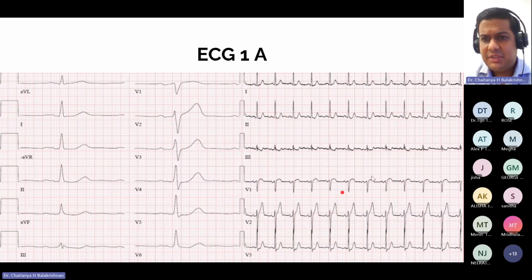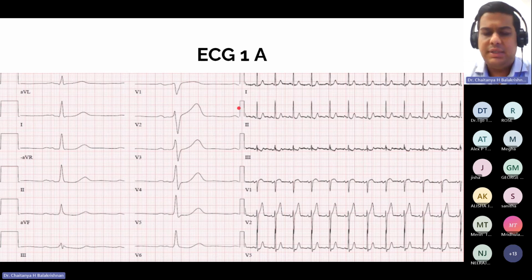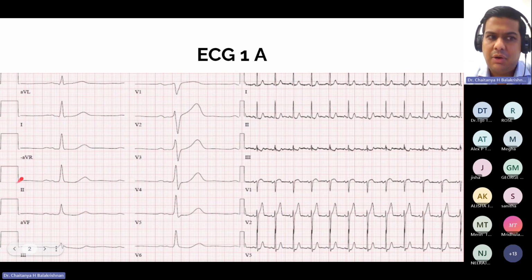As he stressed, when you look at an ECG, and this is something I always teach, never start reporting an ECG unless you look at this block on the left, where my pointer is. That is an inscript which shows you whether the ECG has been calibrated correctly or not. This annotation should always be 2 boxes in height and 1 box in width, that is big boxes.